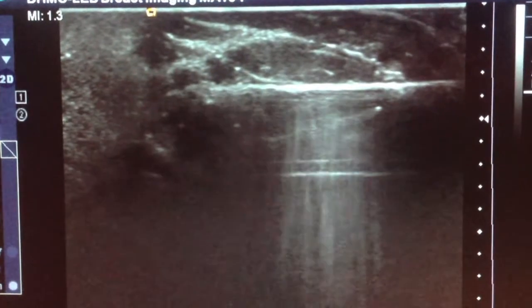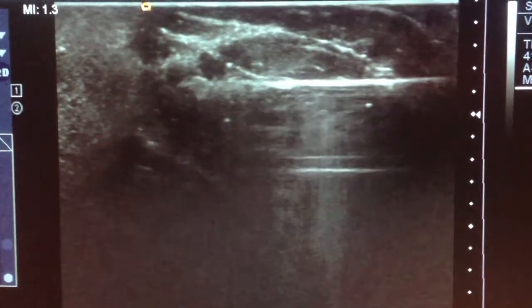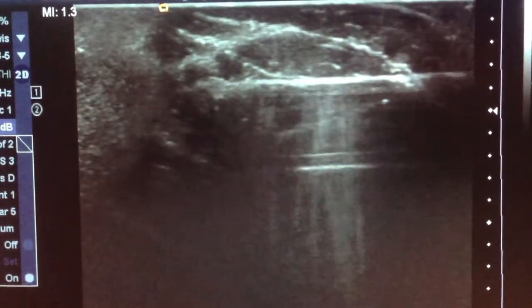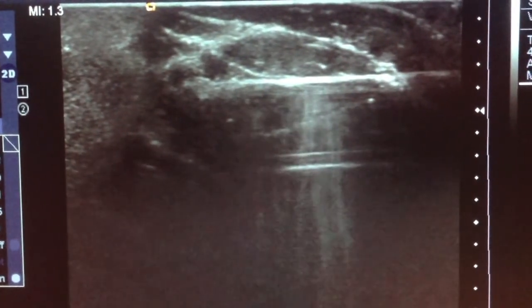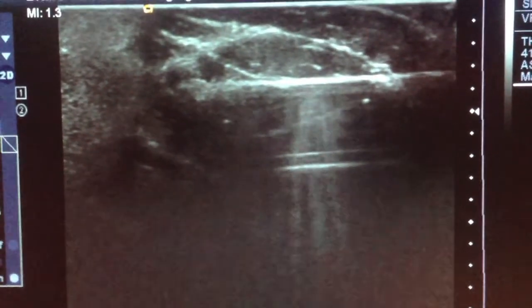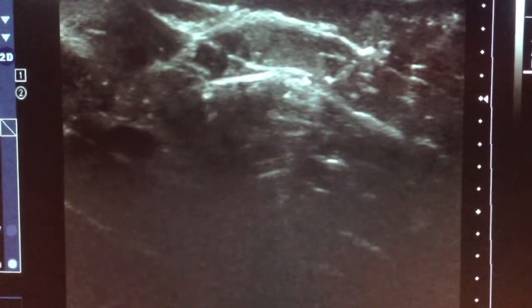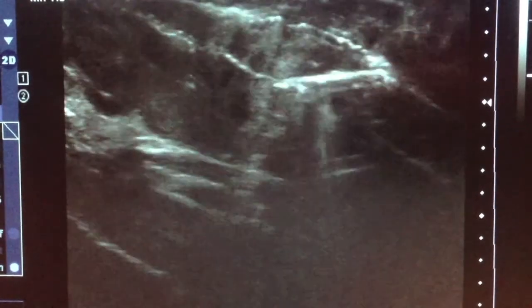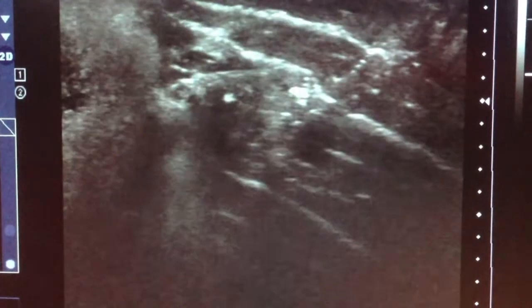One of the advantages that we have in the breast, as opposed to in the liver or thyroid biopsy, is the flexibility of the breast. Although sometimes it's a problem for us, it can actually help us localize on lesions. So here she's actually at the edge of one of the lesions rather than centrally. And so there's a number of things you could do. You could come back and completely re-aim, but sometimes that's a pain. You can try and push towards yourself or pull towards yourself, but sometimes the whole lesion moves with you.